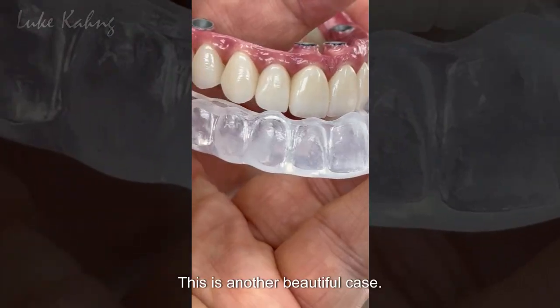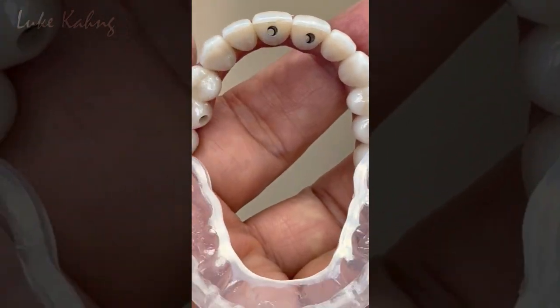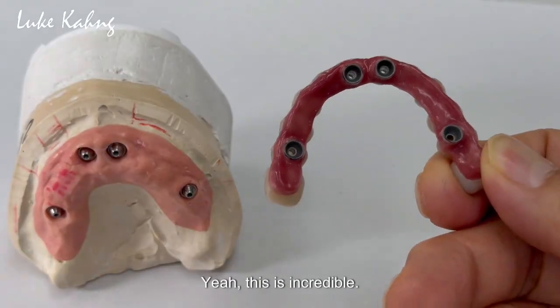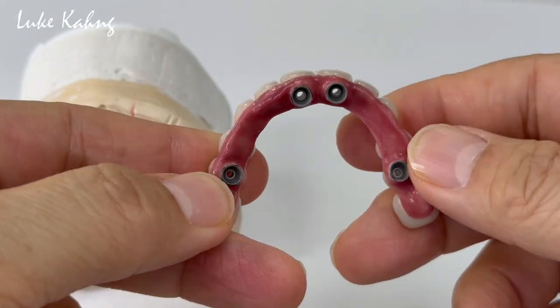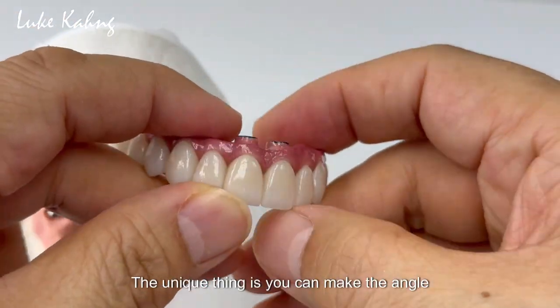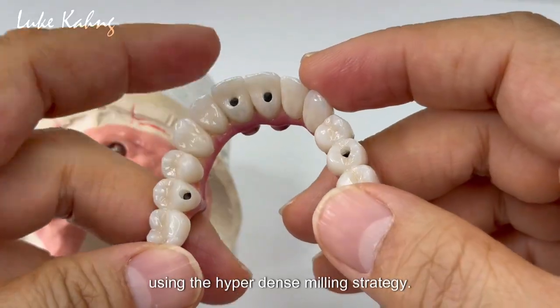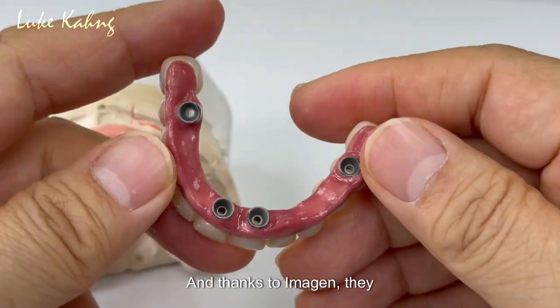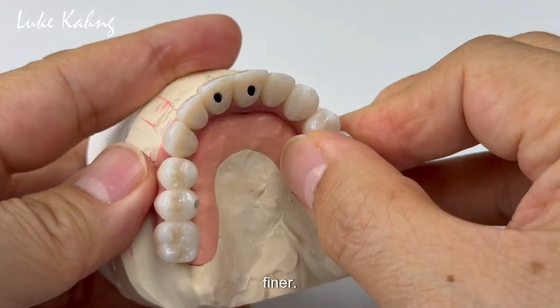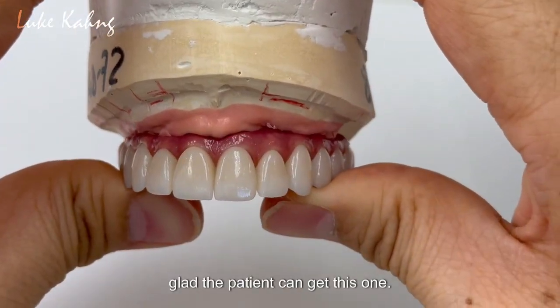So this is another beautiful case — incredible four implants. Sighton 7-star, very very thin like this. It's very thin entirely, only four implants from the front. The unique thing is you can make the angle screw here. The milled 7-star cases are very difficult using the hyper-dense milling strategy. And thank you, Imaging — really nice job. This is a good final result — really thin. Looks like teeth, so glad the patient can get this one.